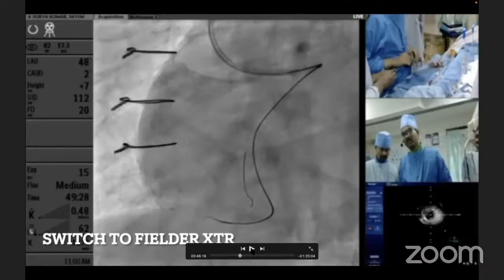Yes, I think you're absolutely right, Himanshu. These are the kind of cases where, at least in my experience, I always keep investment procedure in mind while entering the case. Because time is going to be the limitation in such patients, and with time, everybody will be fatigued. And radiation, you are seeing 2000 milligray, 1500 milligray, your mind starts clicking.